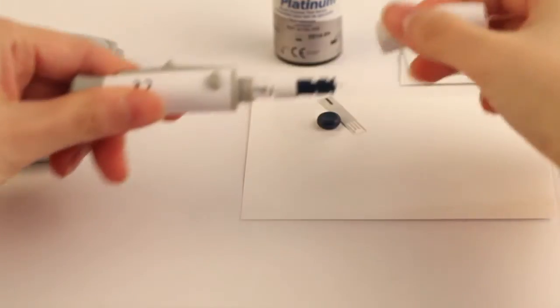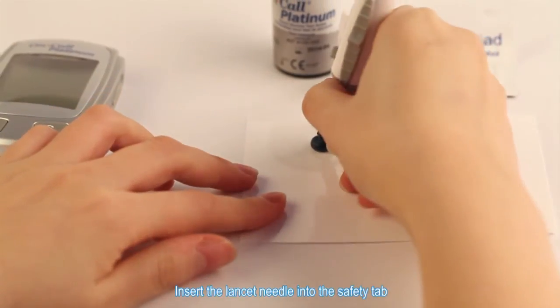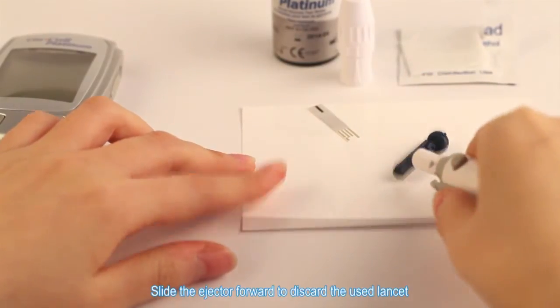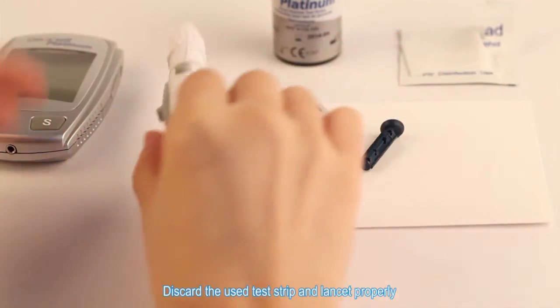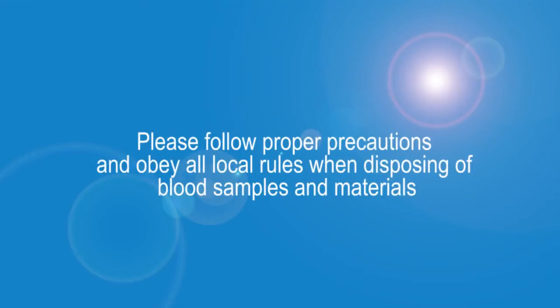Unscrew the lancing device cover. Insert the lancet needle into the safety tab. Slide the ejector forward to discard the used lancet. Place the lancing device cover back on. Discard the used test strip and lancet properly. Please follow proper precautions and obey all local rules when disposing of blood samples and materials.